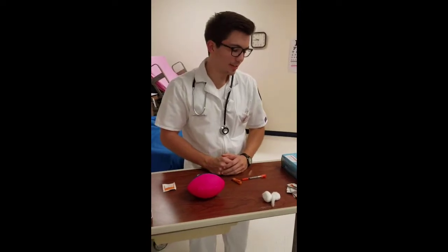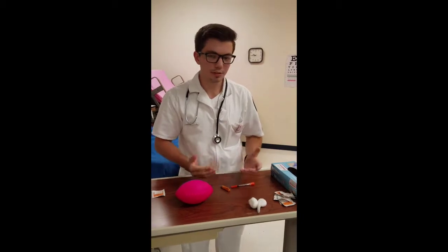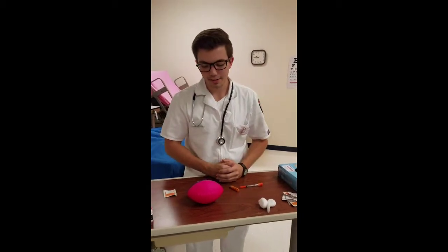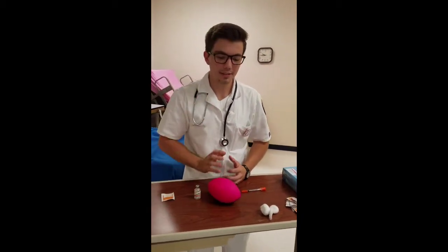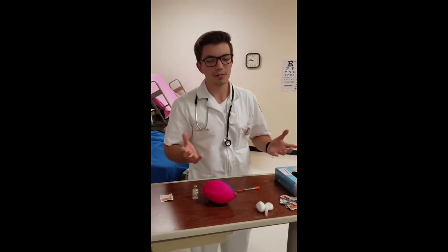So this is going to be insulin administration. First, you're going to need to take your blood sugar, and for this we're going to say that my patient's blood sugar is 175. So according to the sliding scale, he's going to need 2 units of insulin.